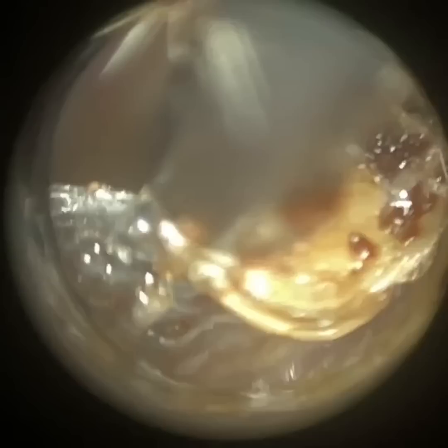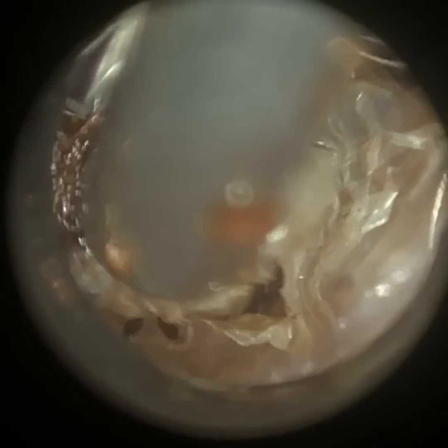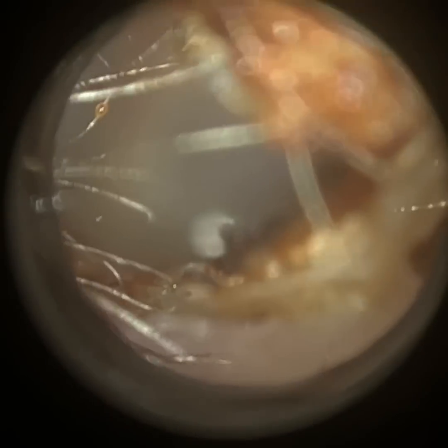So I'm just using the fine end. And it's quite stubborn skin. And you can see how all the individual skin cells are still interconnected. You can see those waves, those ribbons. And peeling skin can be quite tricky because it can be quite adhesive.